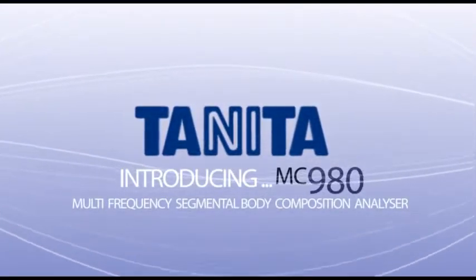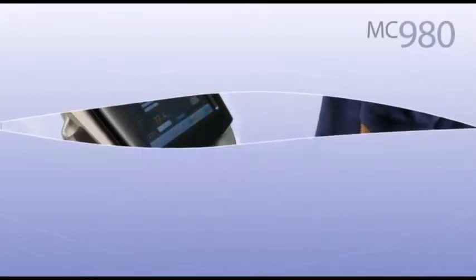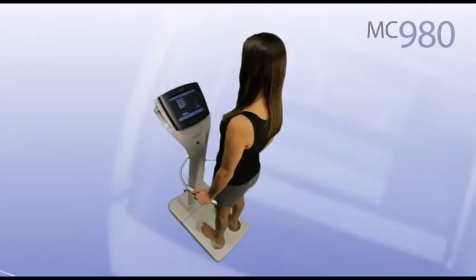Tanita, the leader in precision weighing and BIA analysis, brings you the next generation in body composition analysis using the latest BIA technology.